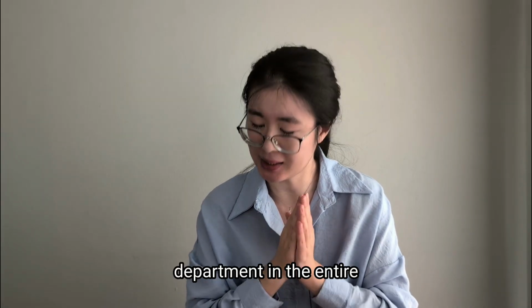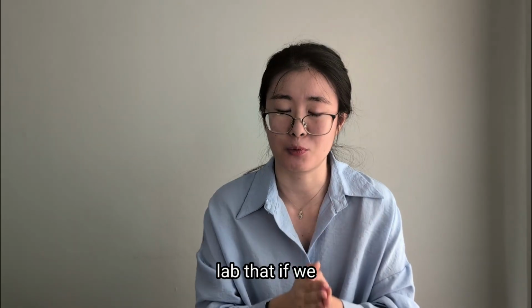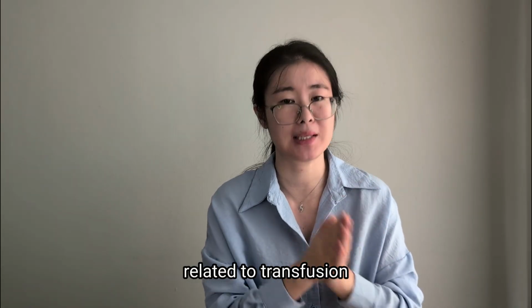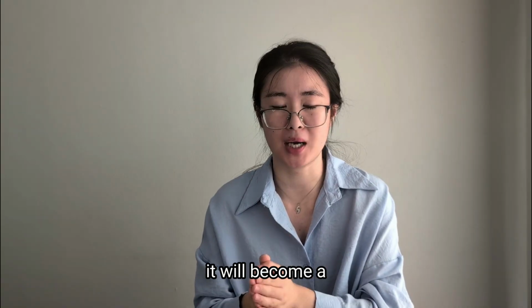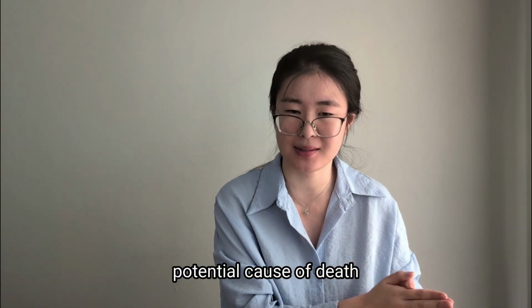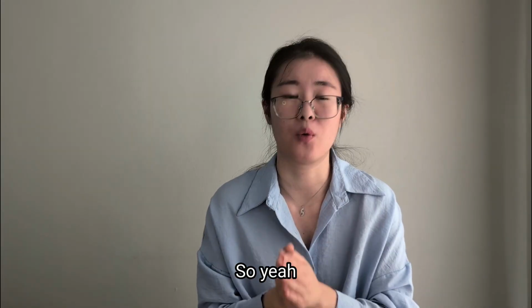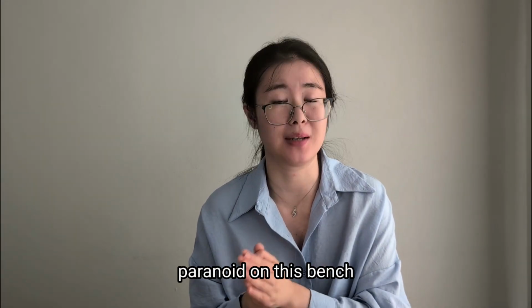This is the only department in the entire lab where, if we miss anything on the patient's treatment history related to transfusion, it becomes a potential cause of death later on when the transfusion actually happens. So yeah, we are all very paranoid on this bench.